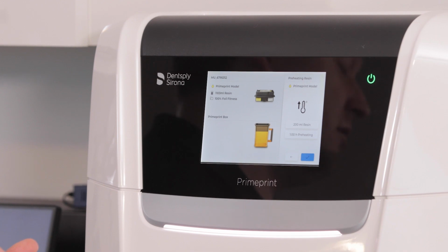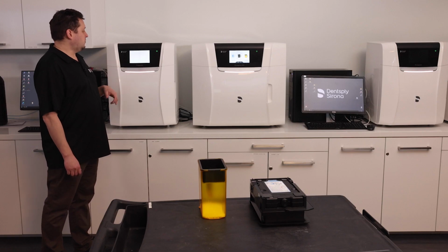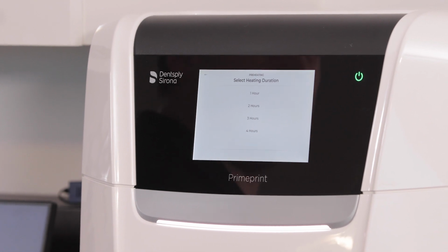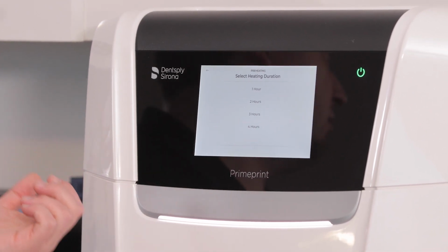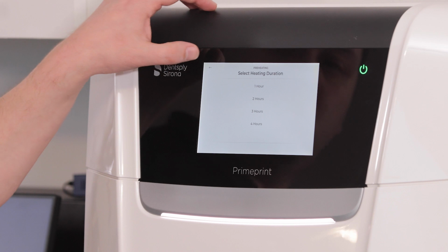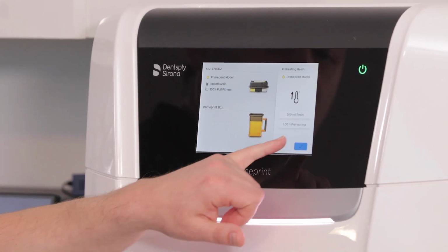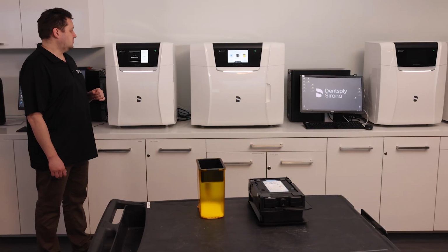and to preheat. We have a second option as well, which is how many hours we would like the printer to keep the resin at the correct temperature, whether it's 1, 2, 3, or 4 hours. Having selected here 200 milliliters for 1 hour, I press the blue checkbox.